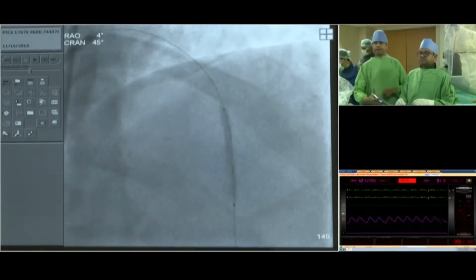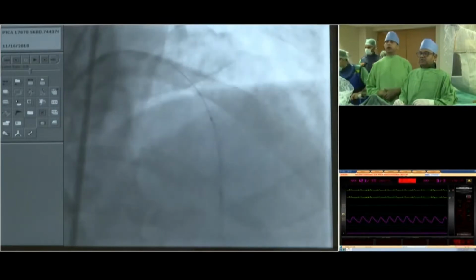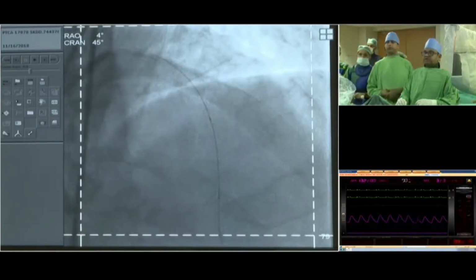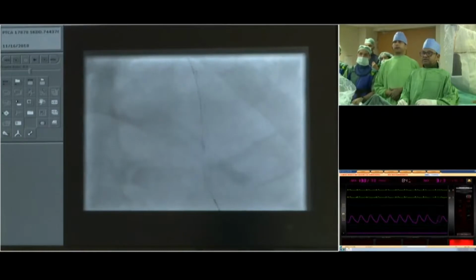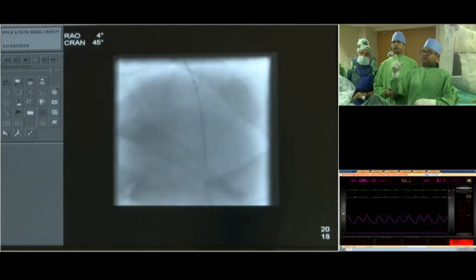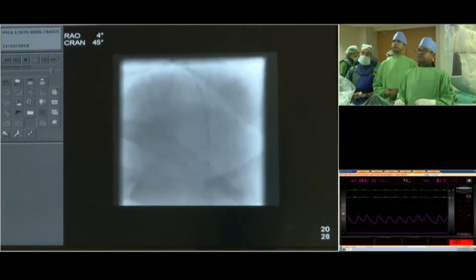Negative, please. Can we show it on the stent boost? Stent boost, please. And collimate it. Can you show the stent boost? Fluoro, please. It helps in finding the markers on the stent boost quite easily. Ready? So can you show the stent boost on the screen?